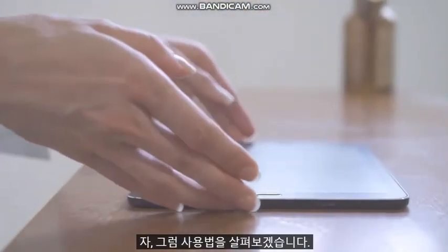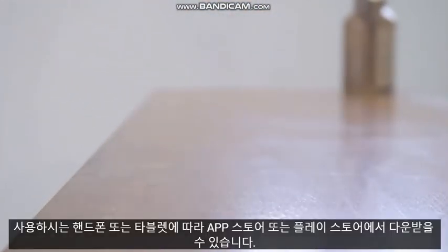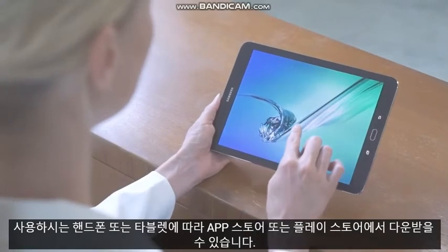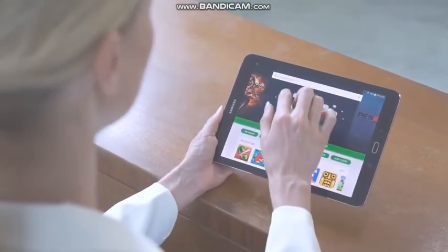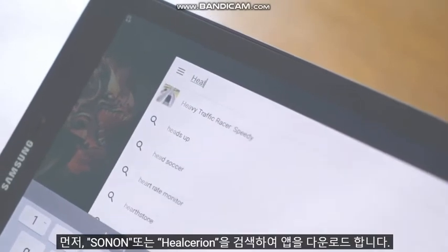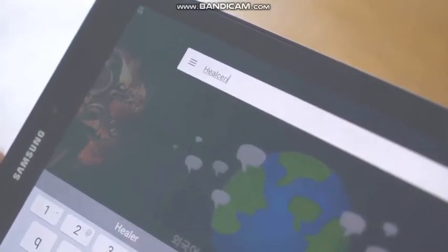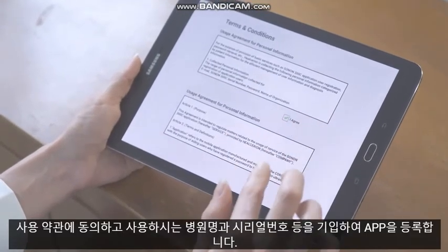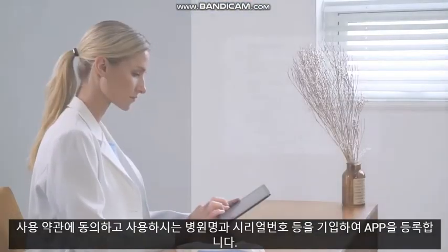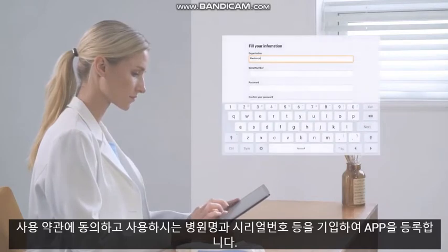So, let's see how it works. The user can easily download the application from the App Store or Google Play Store according to the type of tablet that the user is using. First, search for the app and download it. Then, agree to the terms and conditions and fill in the required information for registration of the device.